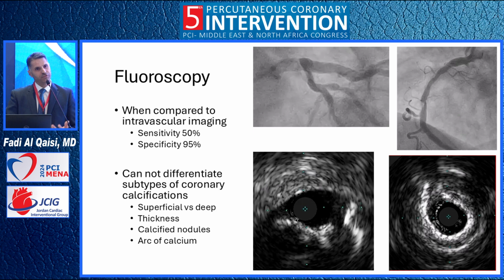Fluoroscopy is not very sensitive. We all here in the hall rely on fluoroscopy and our eyes, but the sensitivity is only 50% and the specificity is 95%. And it is deceiving. These are two cases I encountered the other day. You cannot differentiate: what's the calcium? Is it superficial? Is it deep? Is it circumferential? What's the thickness? Is it all around the artery? Is there a nodule? I cannot tell.